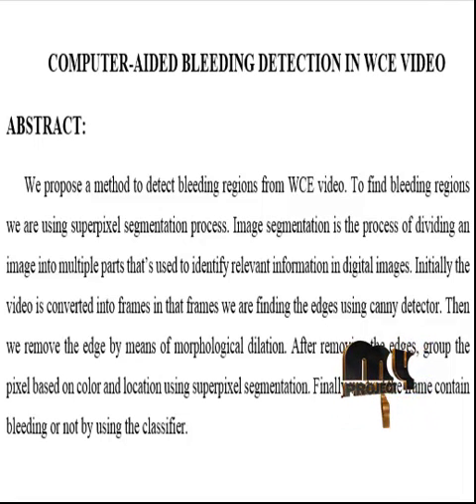The video is read and the median filter is applied for the removal of unwanted noise in the videos. After that, the smoothened images, which are the result of the median filter, are used for the next process. The edges were detected using canny edge detection methodology.